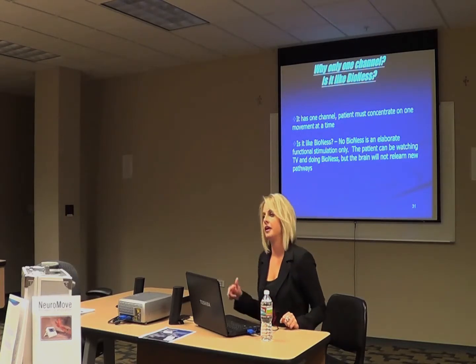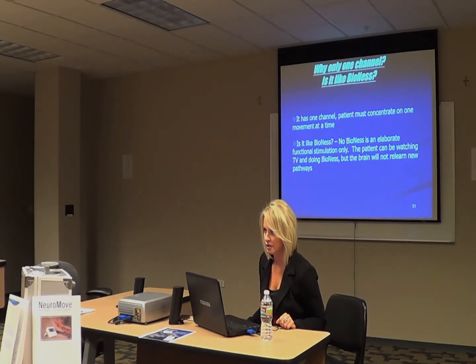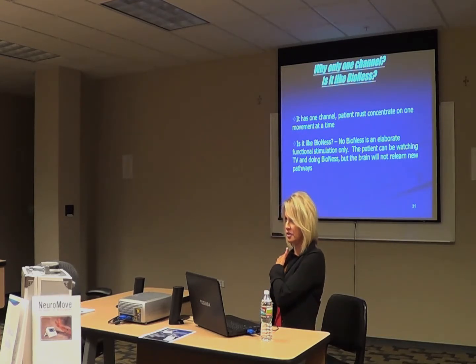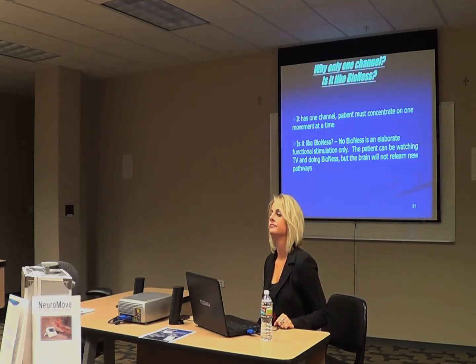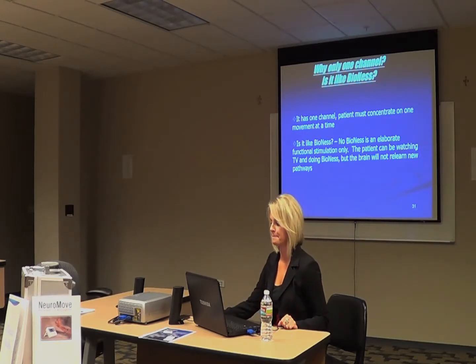Now, since you brought that up, I have seen patients that get into the mode of trying to move their hand, and they actually put their shoulder into it. So I tell therapists to just hold their shoulder back and make them only use their hand, so they can't engage it. Because I do have a patient who uses his upper back a lot. Yeah, just isolate to make sure that they're not. Okay. Got it. Thank you.